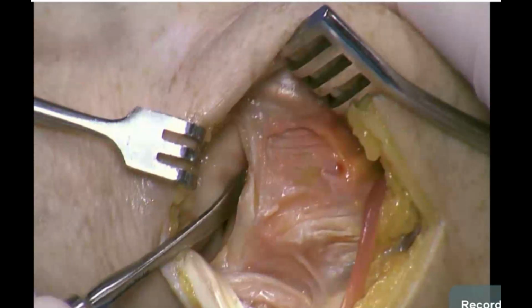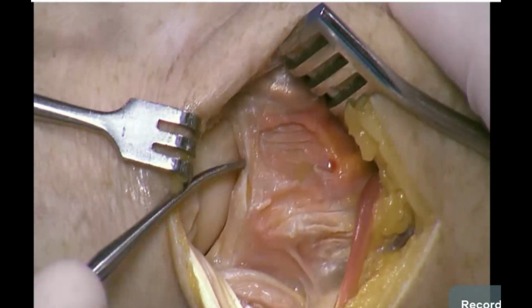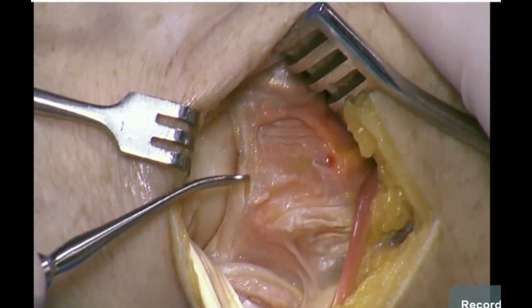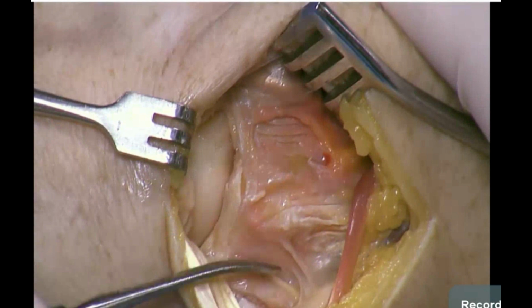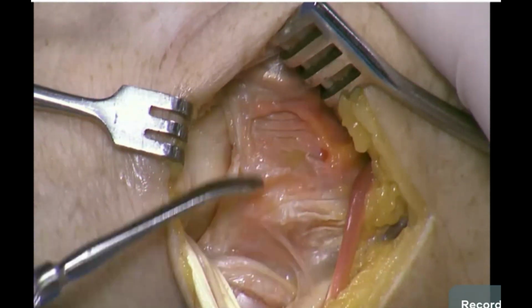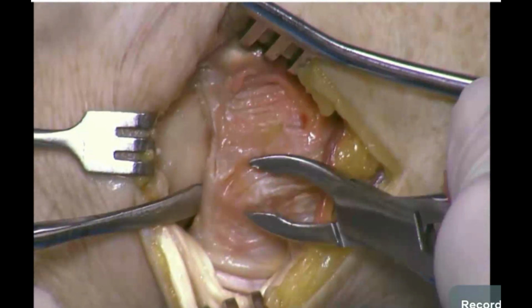Very frequently, the fracture line in the joint is going to be extending up here, and if a knife or elevator is placed first into the fracture line, then the soft tissue at the dorsal lip of the radius can be released, and these frequently scaphoid facet and lunate facet fragments can be booked open, affording access even down deep in volar. And now we need a rongeur.